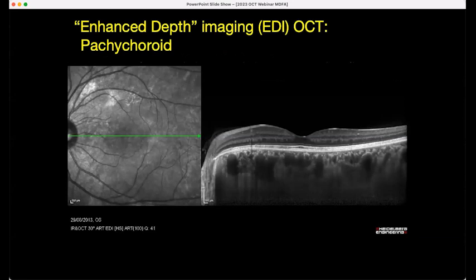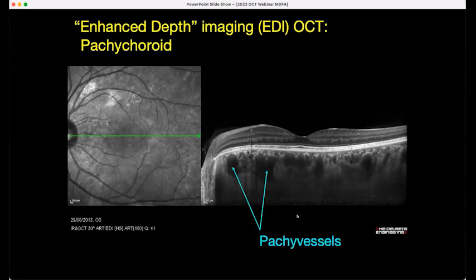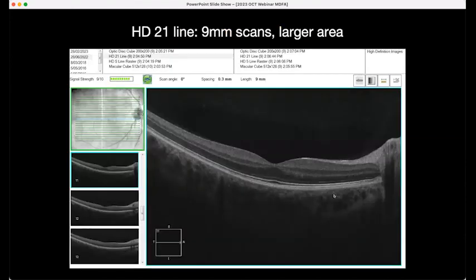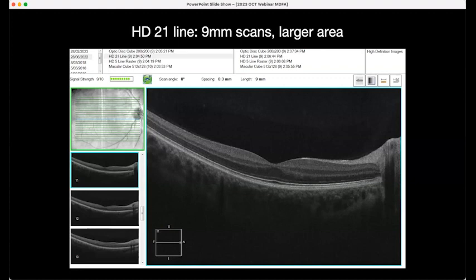This is an example from the Spectralis of EDI — a case of pachychoroid where the choroid is very thickened, with the so-called pachy vessels — those abnormally dilated vessels — and not much in the way of choriocapillaris. You can also cover a larger area with raster scans using the 21-line pattern: nine-millimetre scans covering a much larger area. They're good when you're looking beyond the very central part of the macula, for example when looking for peripheral areas of activity in CNV.